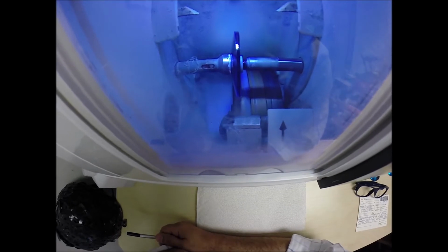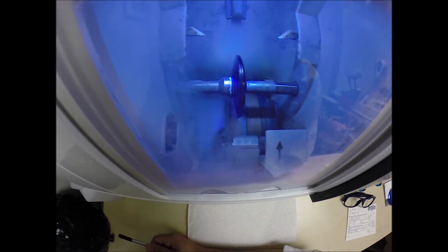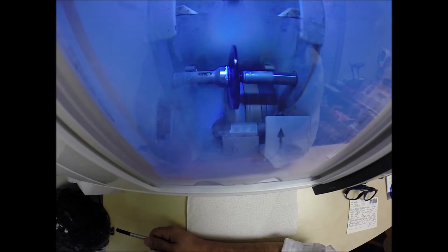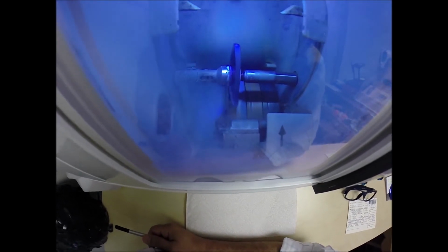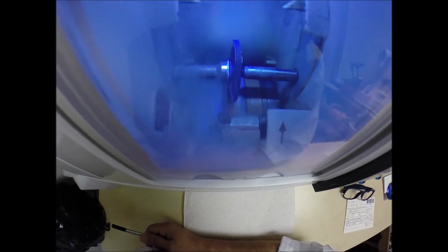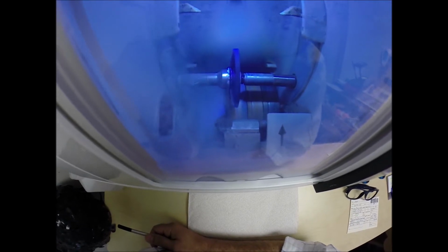All right, Secret Agent 2840, you win. I'll clean the door. But the light you see flickering in the background is water. That's there to catch the optical sawdust as it comes off the cutting wheel. Polycarbonate lenses cut dry, meaning that no water sprays onto the lens while it is cutting. Unlike plastic, high-index plastic, and Trivex that do cut wet, meaning that water sprays onto those lenses for the duration of the cutting cycle.